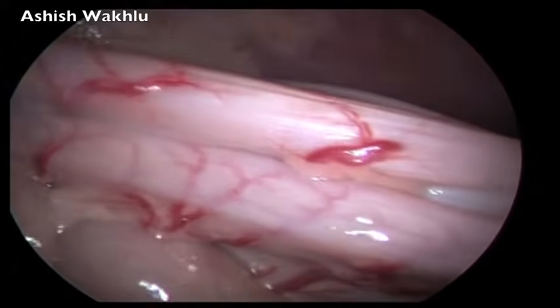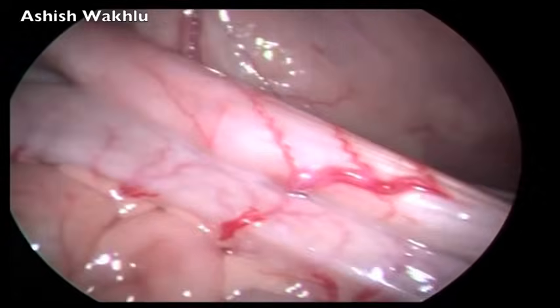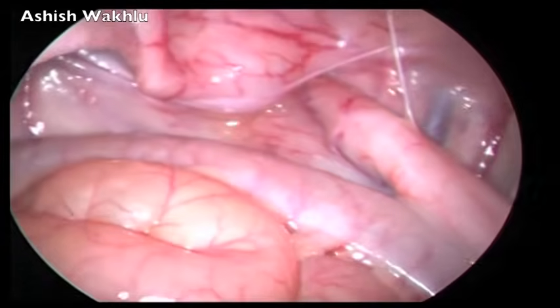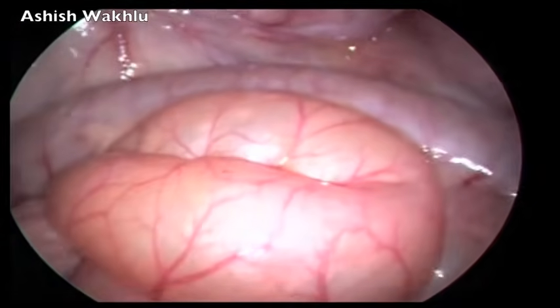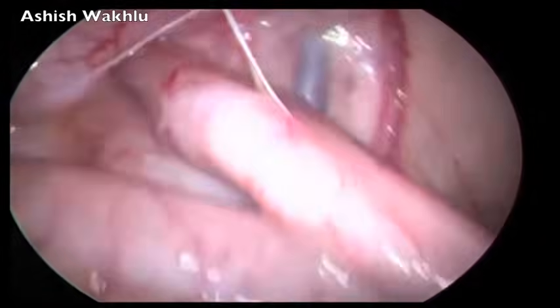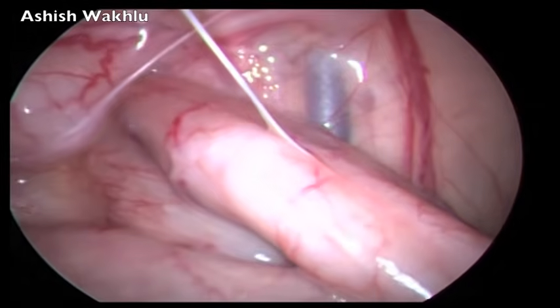From here, the proximal bowel doubled back towards the pelvis and then towards the left abdominal wall as the descending colon.